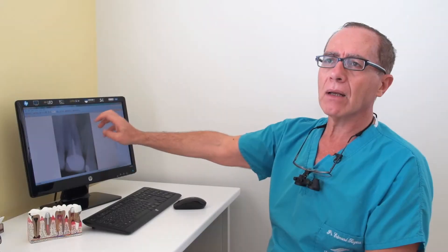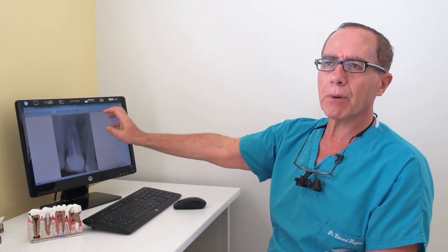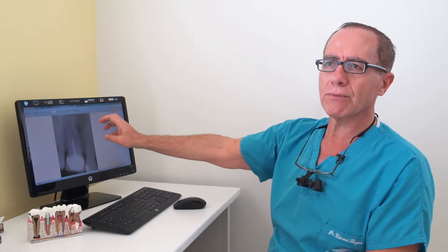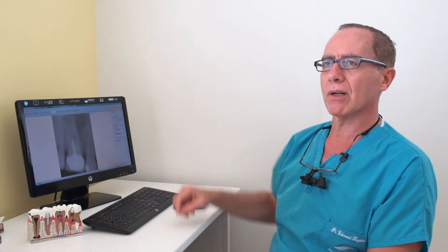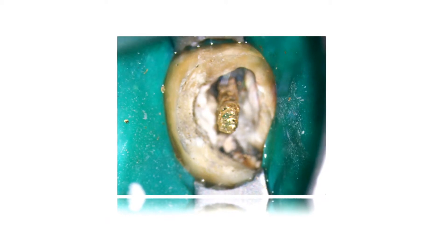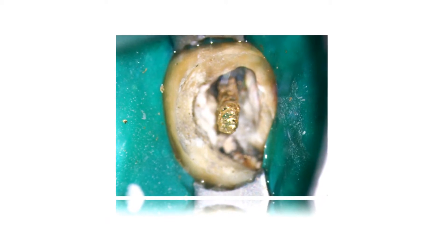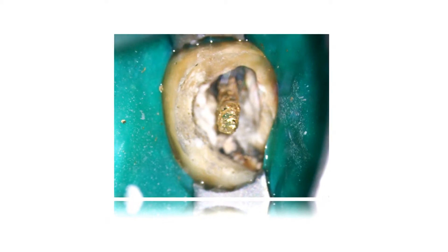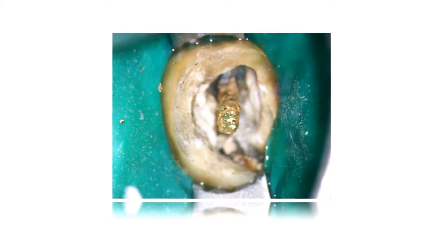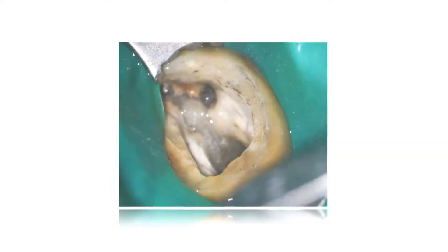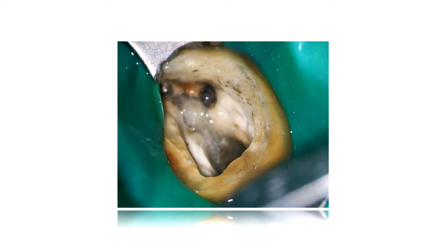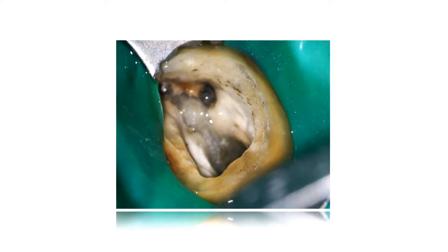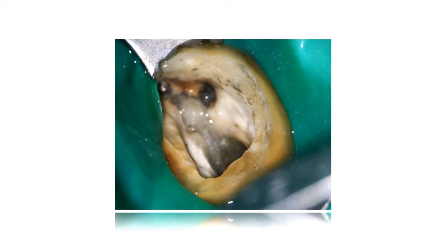One of the reasons might be not using the proper tools — in our case, the microscope. The procedure was to remove the crown, retrieve the post, and redo the root canal to give the patient the best chances of healing while keeping the natural tooth in place.